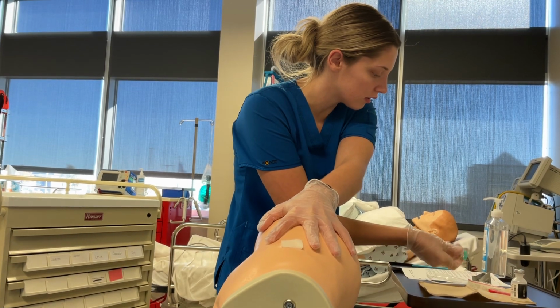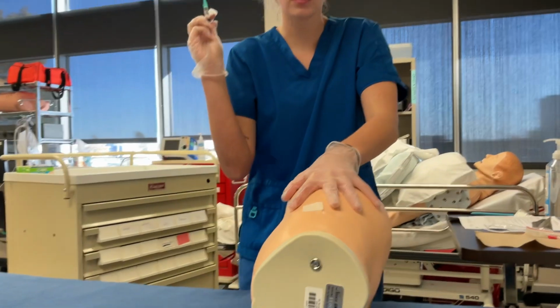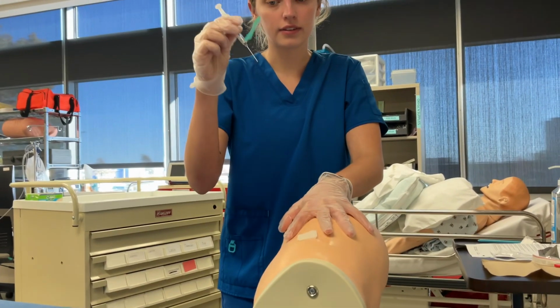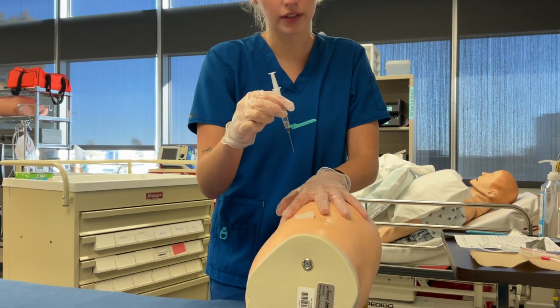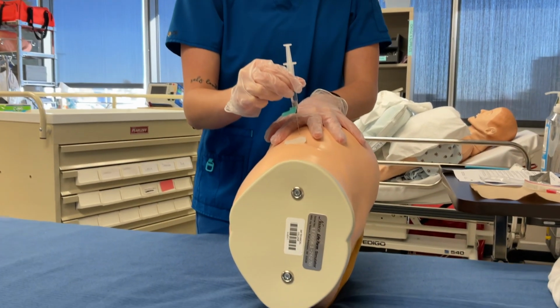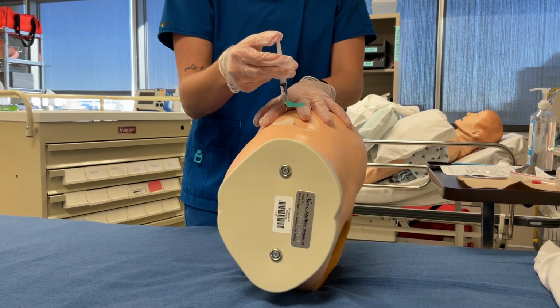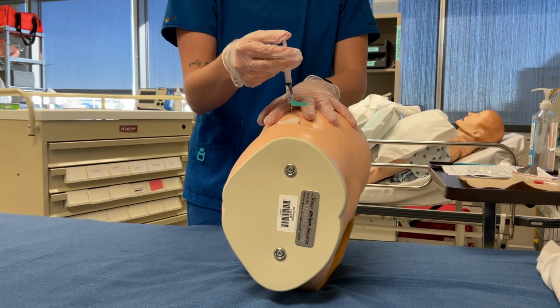One hand, and I will hold it like a dart. Once it's dry, insert at a 90-degree angle while I'm pulling the skin taut. Insert at a 90-degree angle. I will inject the medication slowly, about 10 seconds per milliliter.